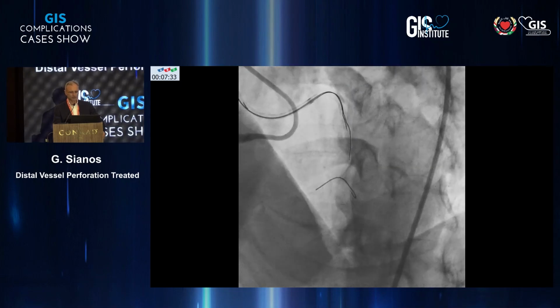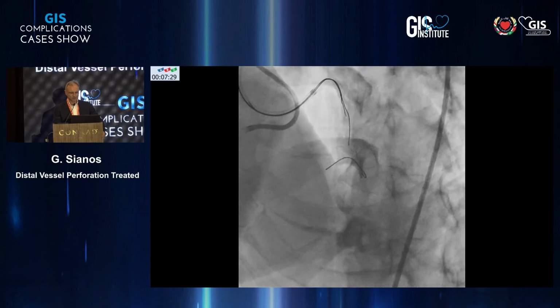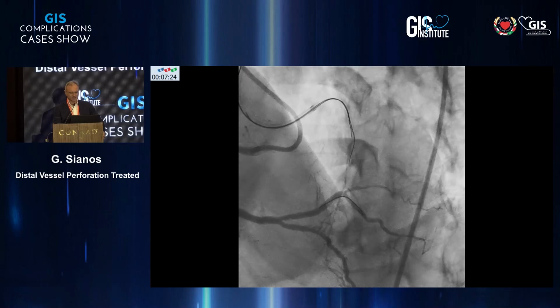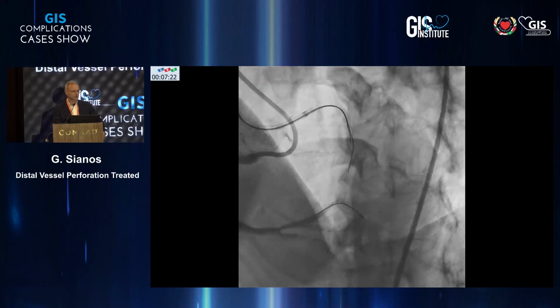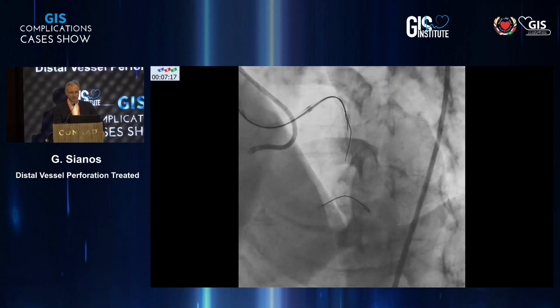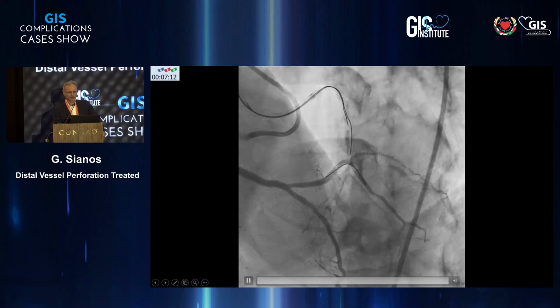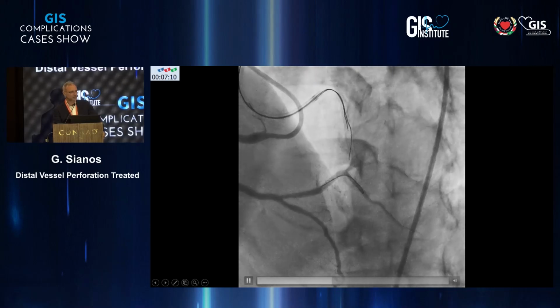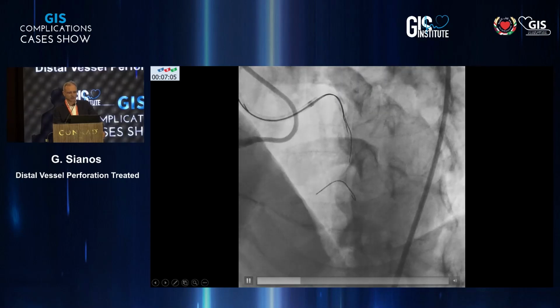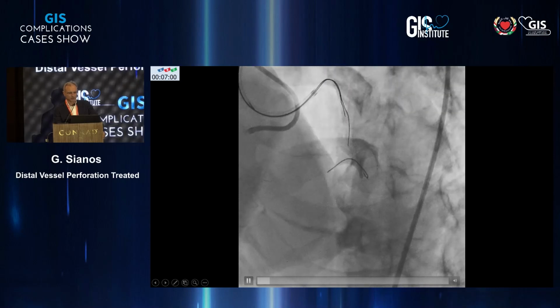Usually the in-stent occlusion cases I would consider not easier, but definitely you have the guide of the stent, you know where to go. There are some more options with knuckling, some other devices. But anyway, this challenge proved to be particularly difficult, and as you can see, it was underestimated. We tried initially with antegrade wire escalation and a Bamba microcatheter supported by different wires, but they went subintimal. Then we took a dual lumen microcatheter, a Sasuke.